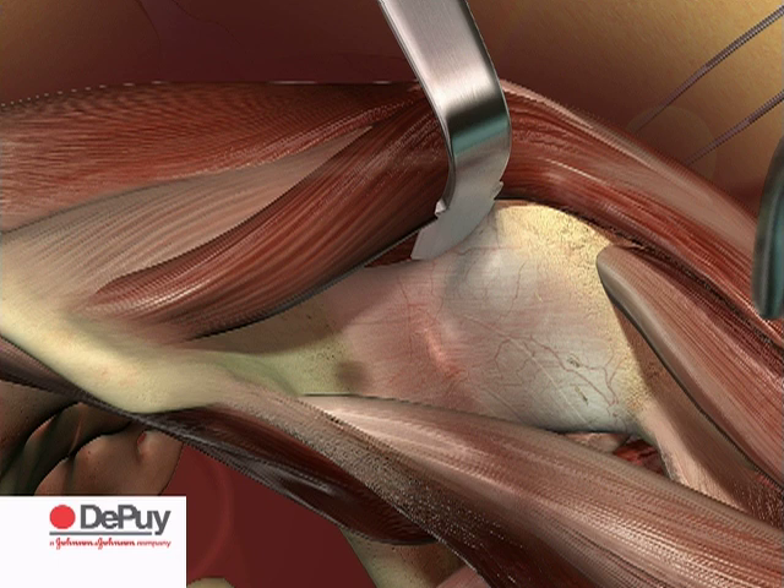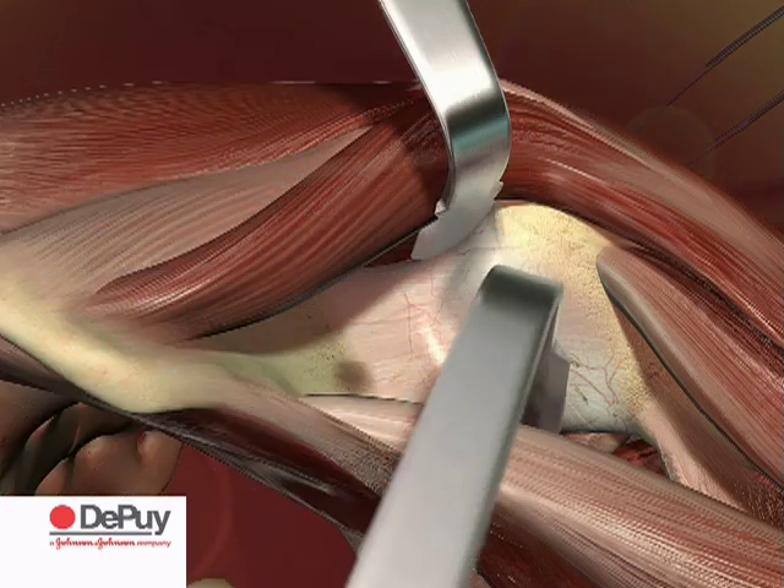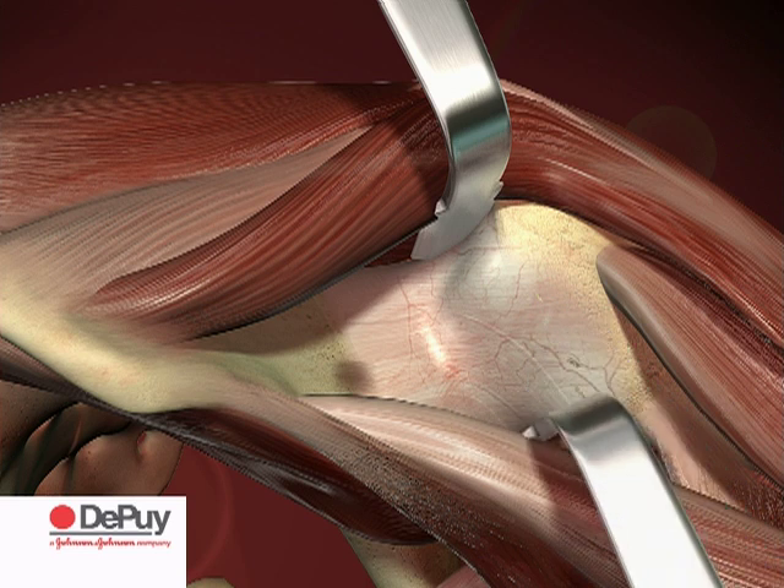Use a second retractor on the femoral calca to retract the sartorius and rectus muscles ventrally. This will expose the capsule over the femoral neck.